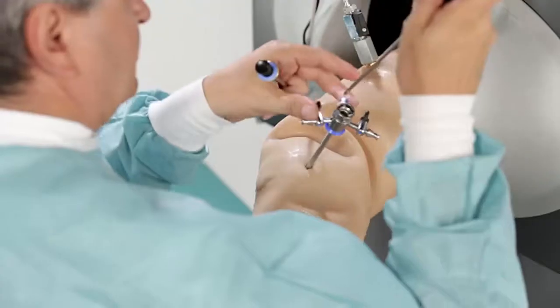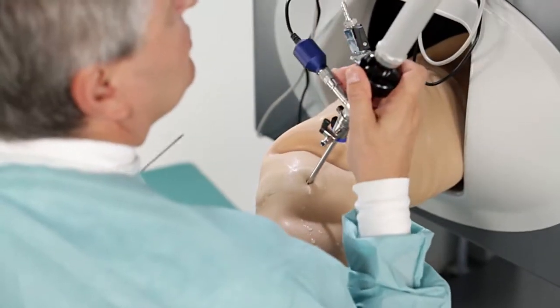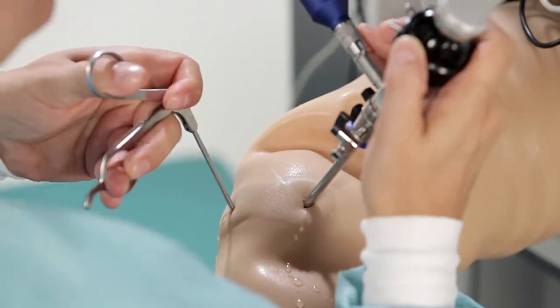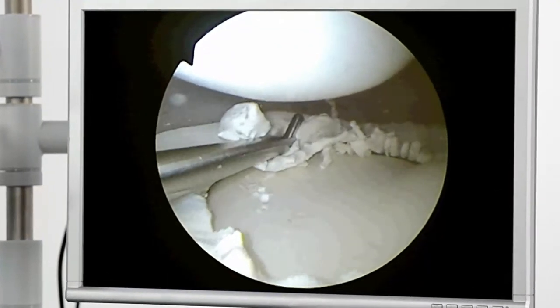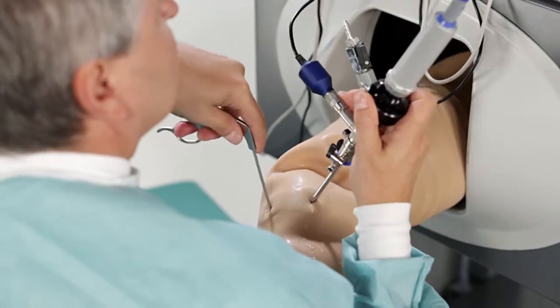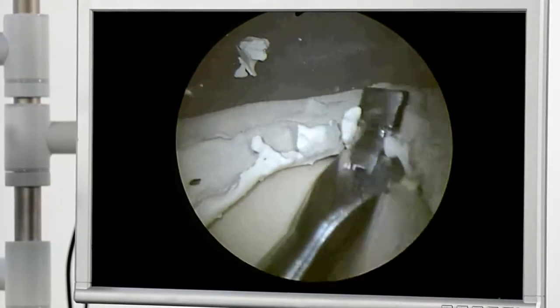After changing the instrument back to lateral, the partial medial meniscus resection is continued on the side section.